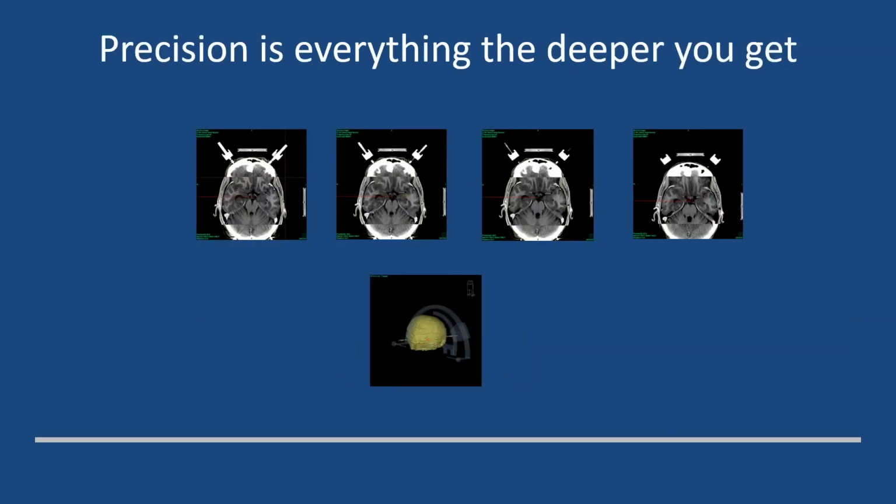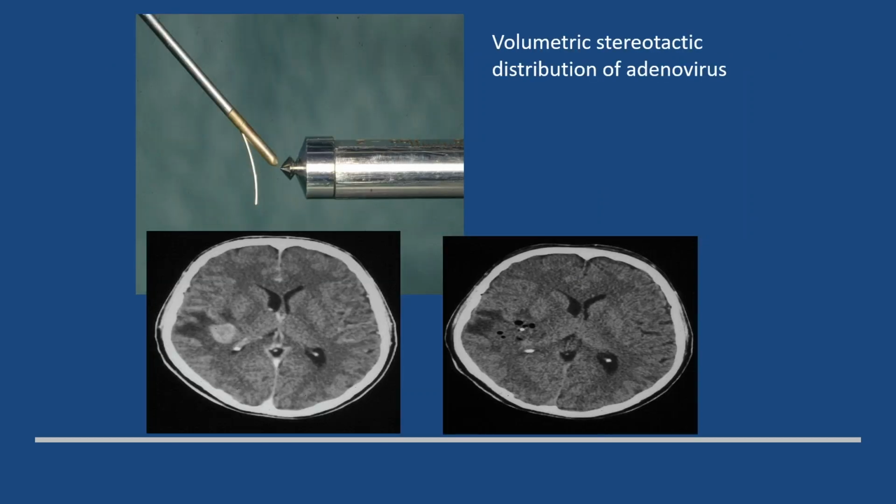So we also use this for catheter implantations, and we just published this 2 weeks ago. This is a series of CT scan fused to the MRI scan where we treat trapped temporal horns by fenestrating them with a Rickham catheter and additional perforations into the prepontine cistern, which allows you then very nicely to prove that you are where you want to be. This is maybe a more esoteric application, but a very nice one which shows the beauty of the intraop image during a procedure to show where you actually were and whether you achieved your goal.